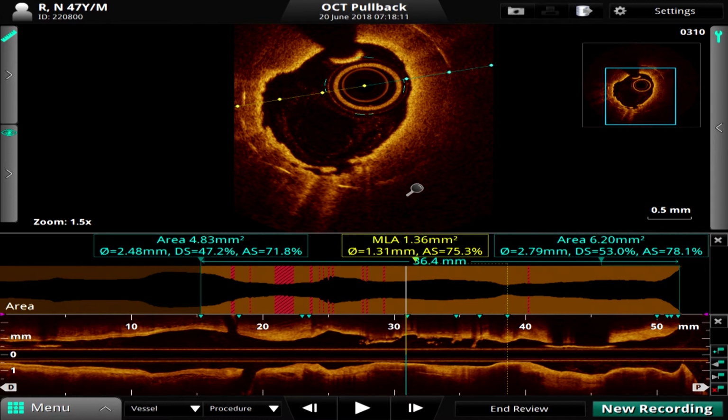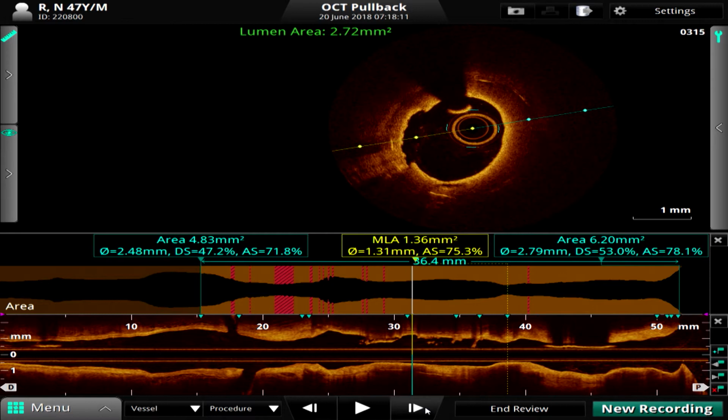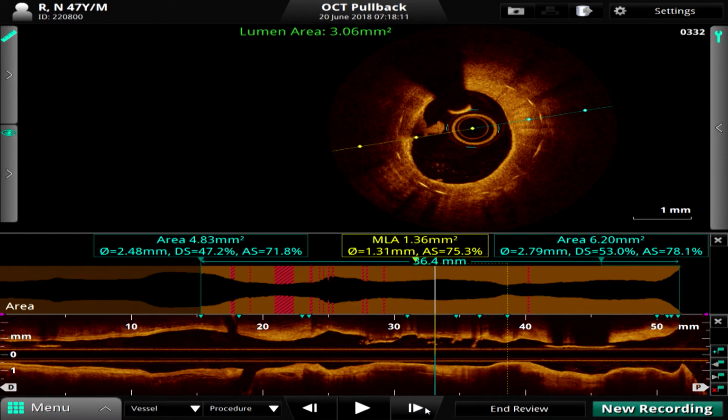So we are not dealing with a classical pure neointimal tissue ISR. This is not the early stage stent failure where uncovered stent struts and malapposition are the issue. Somewhere along the path, atherosclerosis has aggressively started invading the neointima. So neoatherosclerosis tells us the stent struts are all well expanded. There is no unexpanded stent. The stent diameters measured in the OCT are 2.9 to 3, and it is a very concentrically expanded stent all the way. So we are dealing with a neoatherosclerosis stent.